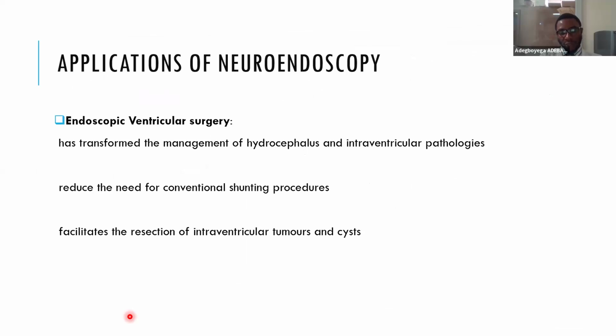Endoscopic ventricular surgery. This approach has transformed the management of hydrocephalus and intraventricular pathologies like intraventricular tumors and colloid cysts. The endoscopic approach to the management of hydrocephalus has minimized the need for conventional shunting procedures.